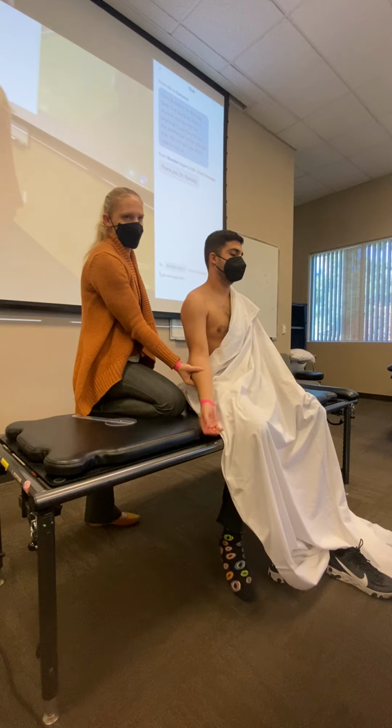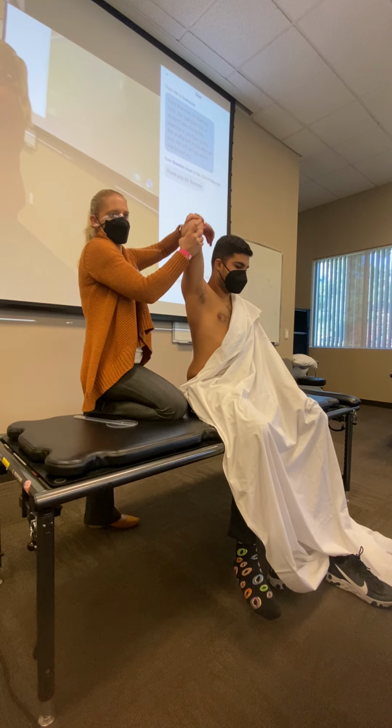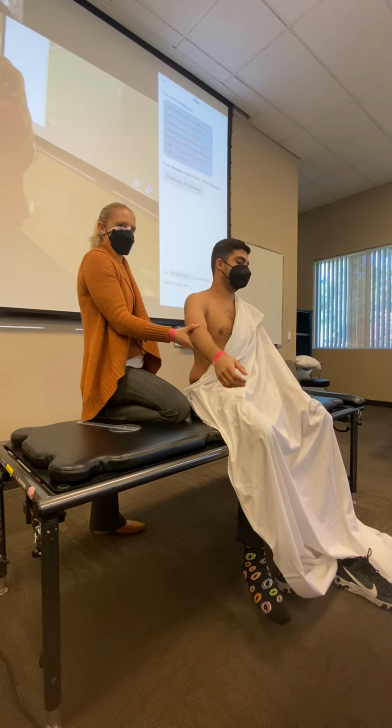So I'm not going to measure supination, I'm not going to measure external rotation, I'm not going to measure shoulder flexion. The only thing I'm going to measure is the elbow flexion that I can get. Does that make sense? Yeah.